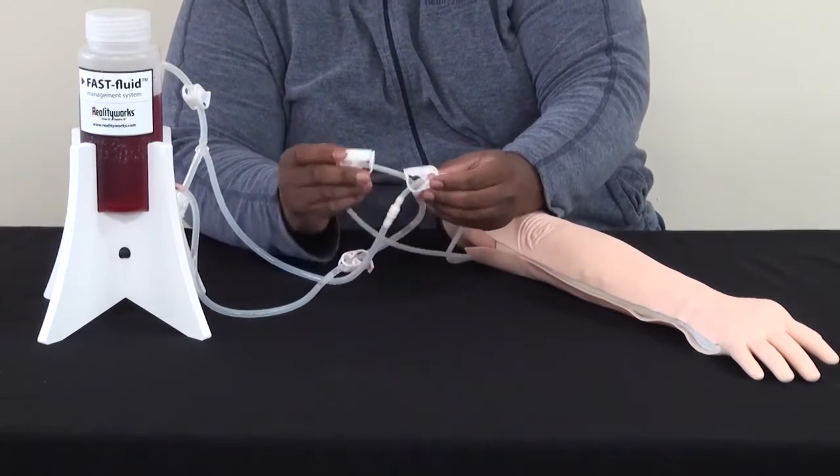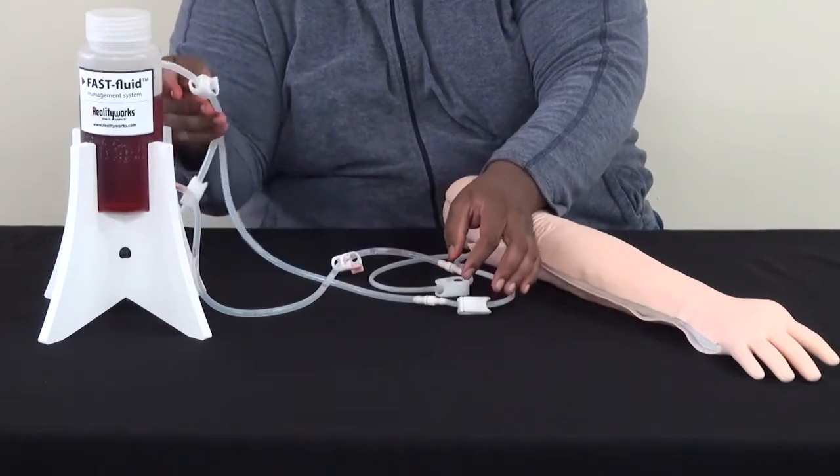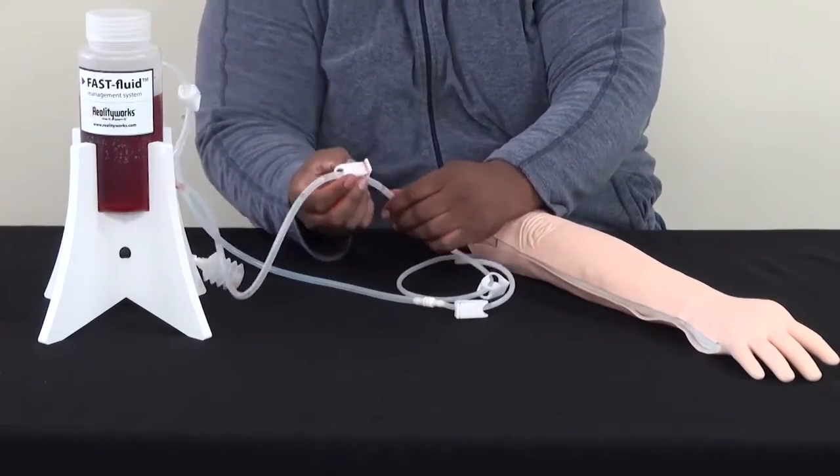Then, making sure the locks are open on the training arm — both upper and lower — you'll then open the upper locking on the fast system itself and then the lower lock.